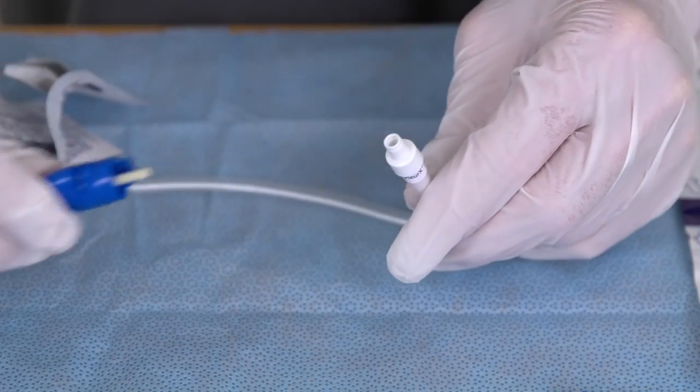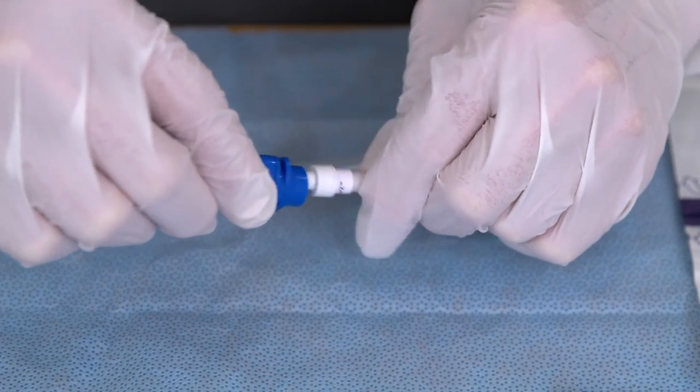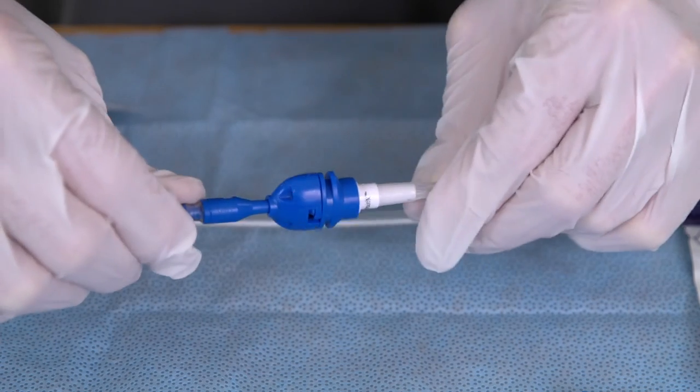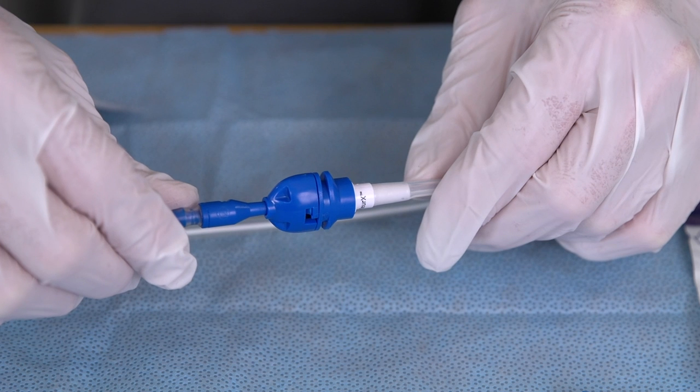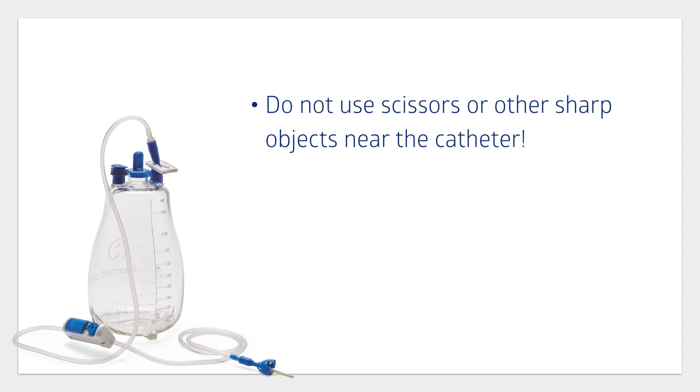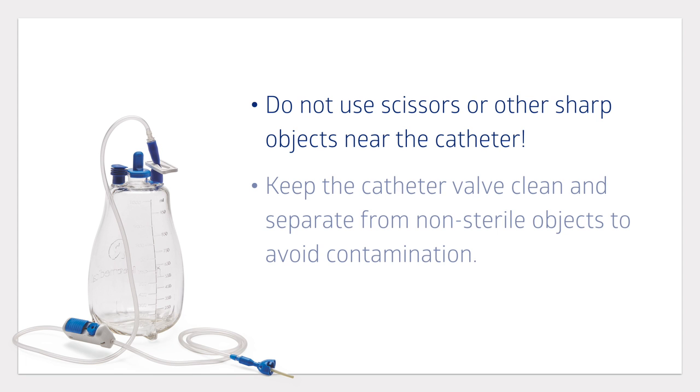Lock the access tip and catheter valve together by lining them up as shown and rotating clockwise. You will hear or feel a slight click. The drainage system and catheter are now securely connected. Do not use scissors or other sharp objects near the catheter. Keep the catheter valve clean and separate from non-sterile objects to avoid contamination.